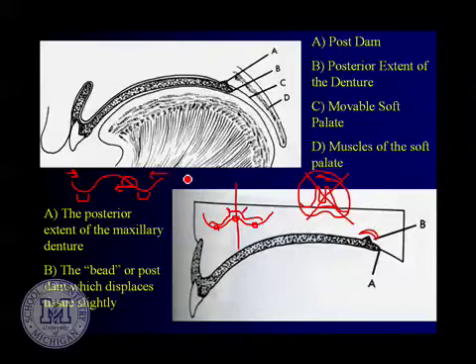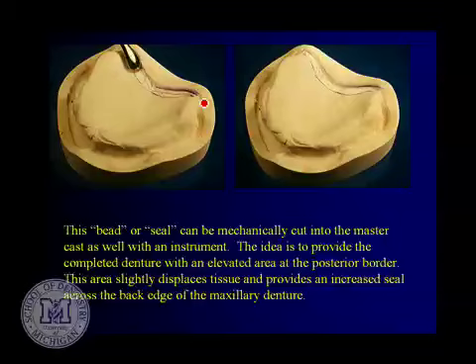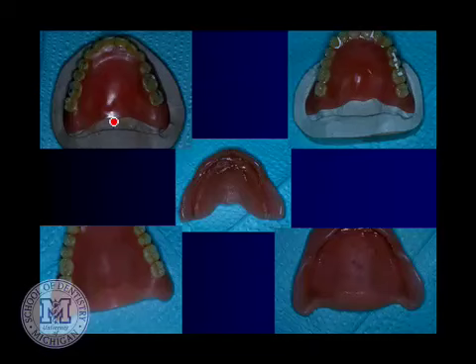Here you can see different phases: we poured our index, cut the back off, and for the post dam modification the color of the pink triad doesn't match perfectly, but it's in an area not seen by the patient and it makes really excellent intimate contact with the tissue and does a beautiful job.